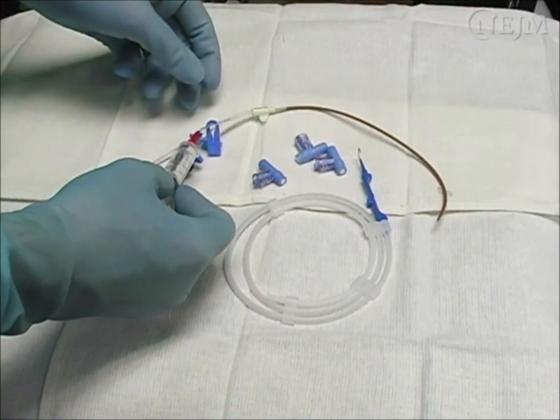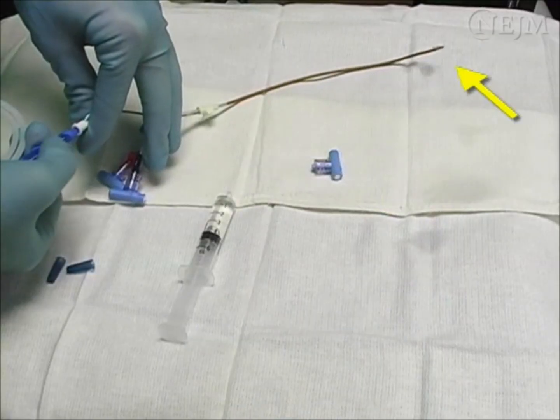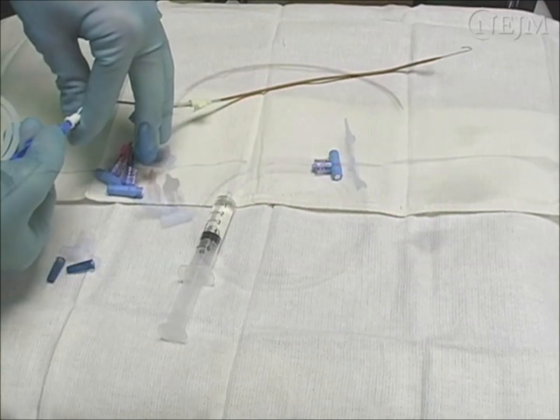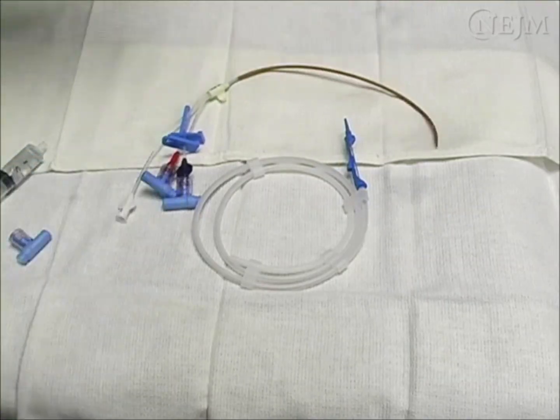Flush the lumens of the central line with saline or heparin, and ensure that the guide wire threads easily through your needle. Remove the cap from the port through which the guide wire will be threaded. This is commonly the longer lumen.